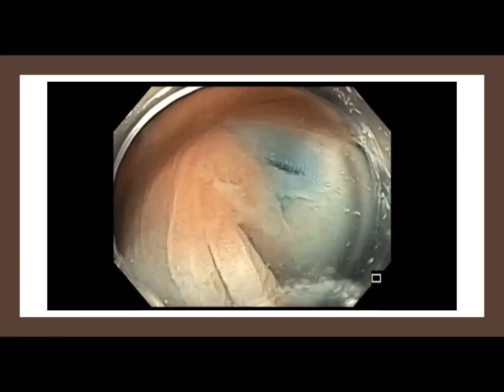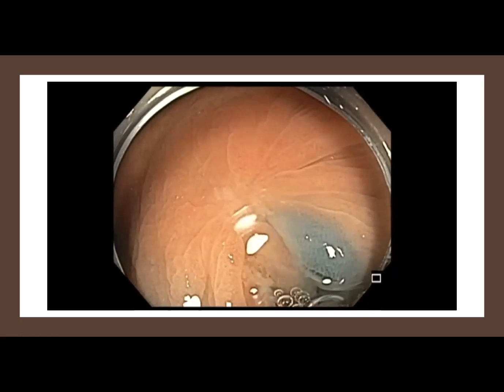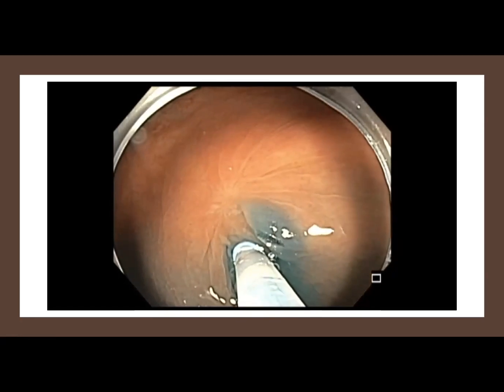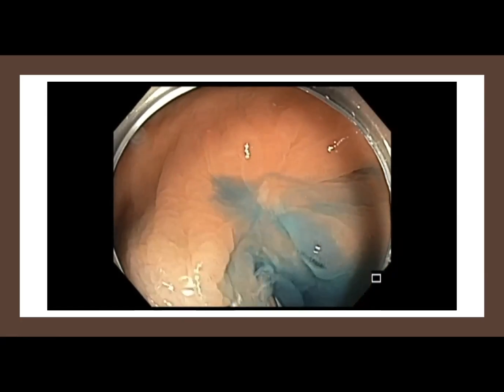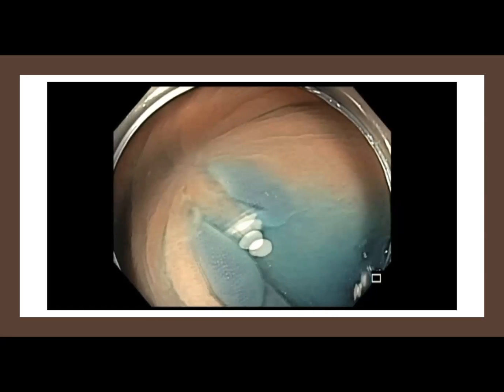They tend not to lift like you wanted to lift. So in that case, you want to keep your injection's point of entry away from the scar as much as possible, so that you can get a little bit of lift. As you can see, the lift was not necessarily satisfactory. So as you can see here, it was much easier probably to cut without injection. And now that I injected on both sides, I have two blebs of similar size and with the polyp in the middle.